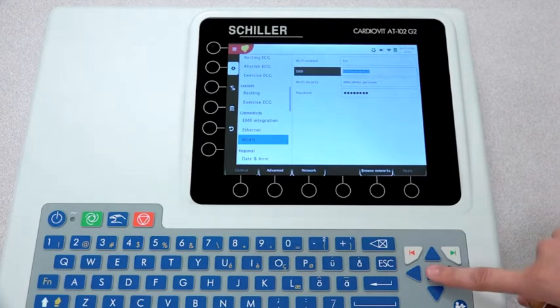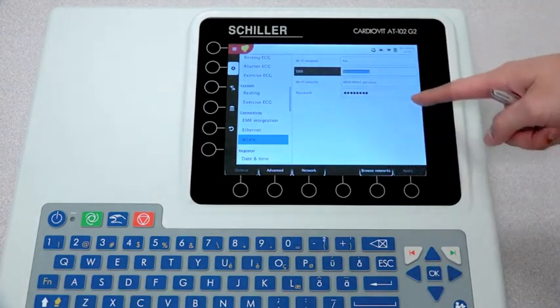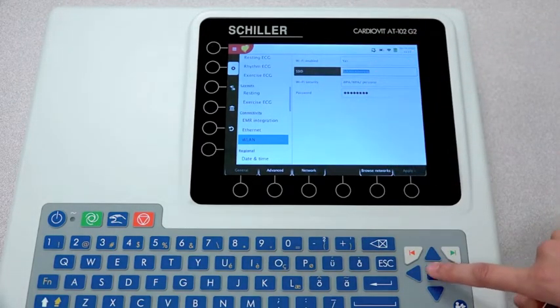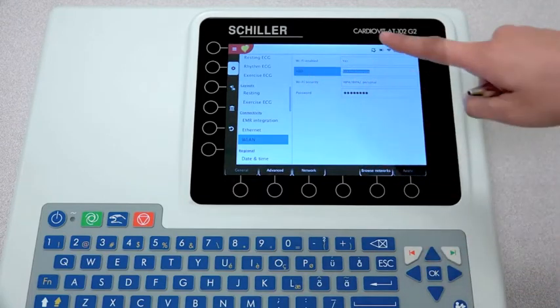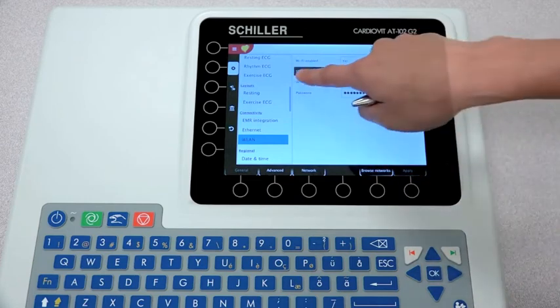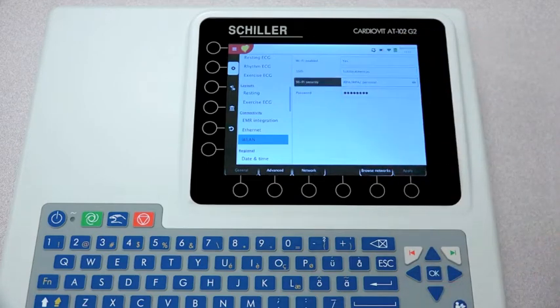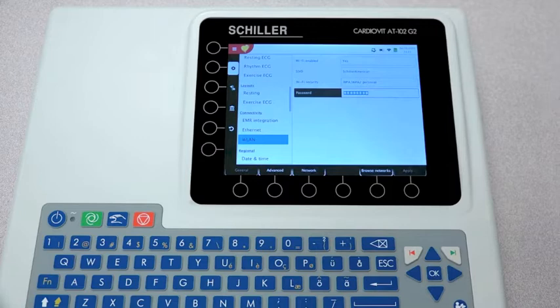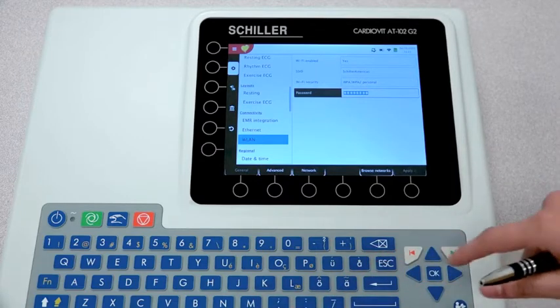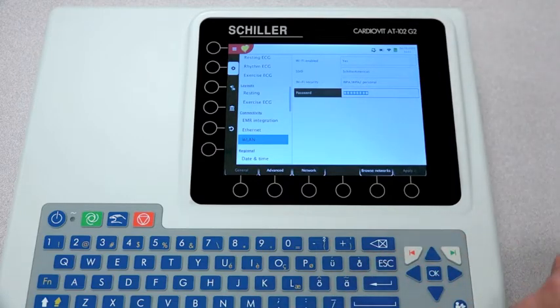All right. And so in order to move on to the next field, you press OK. Oh, actually, once it's blue, you can change. In order to move down, you press OK one more time. Once it's black, then you can scroll down. And here is where you can enter your Wi-Fi password. All right, so be sure to enter the Wi-Fi password correctly and you are good to go.